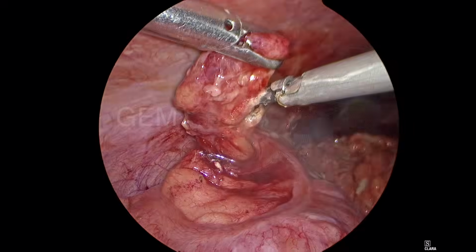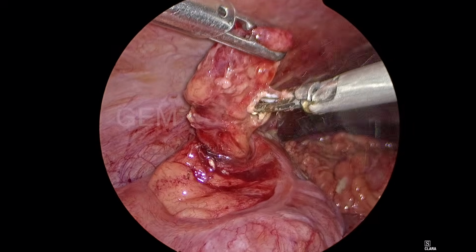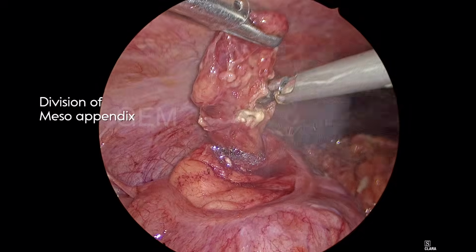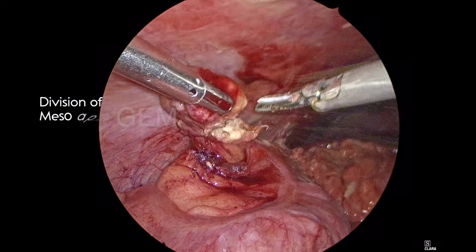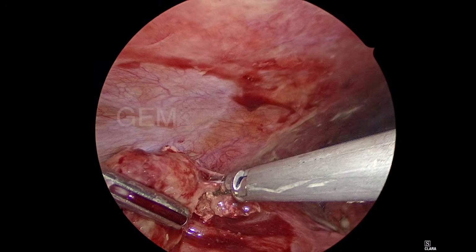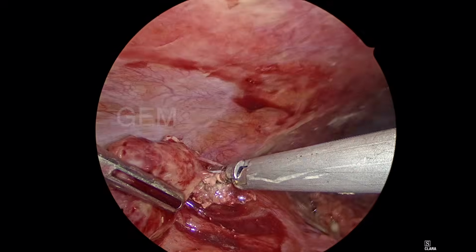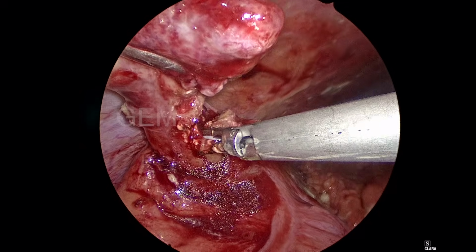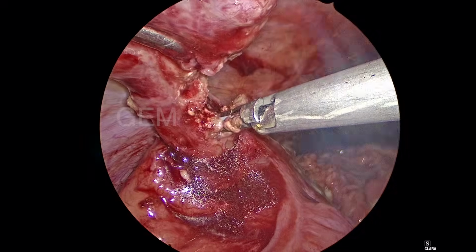So I am dividing the meso appendix with the harmonic scalpel. If you have monopolar or bipolar, sometimes you require a clip before division, but harmonic is good enough, you can divide. So it is one of the very good instruments for appendicectomy. I am just dividing the meso appendix.